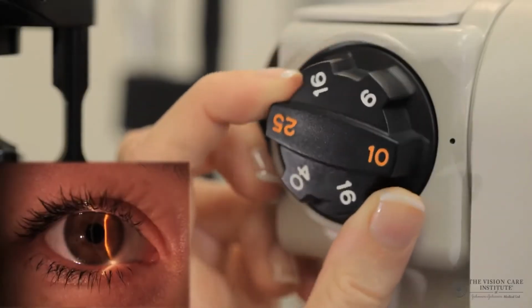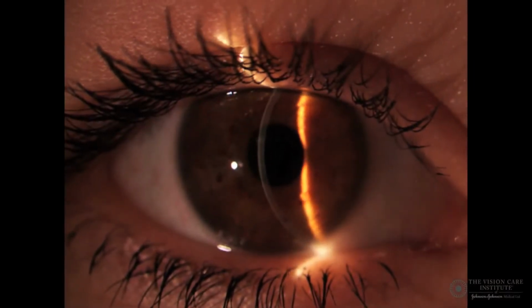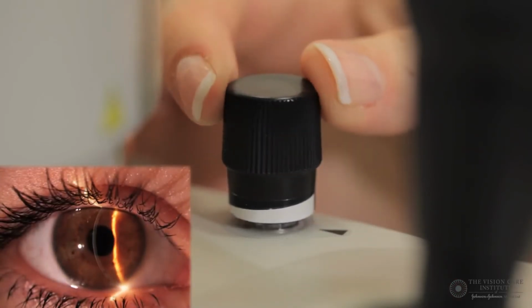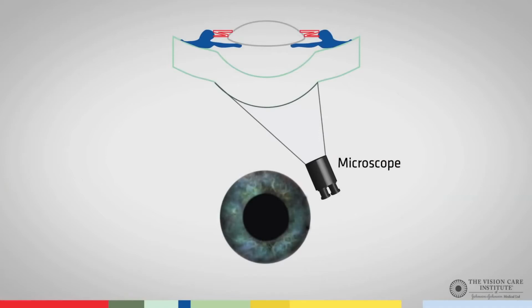Focusing might be helped by increasing the magnification. Here we have the section fairly clearly in focus, and because we have the slit very thin, we can increase the brightness as much as we can. This diagram shows what layers will be visible.